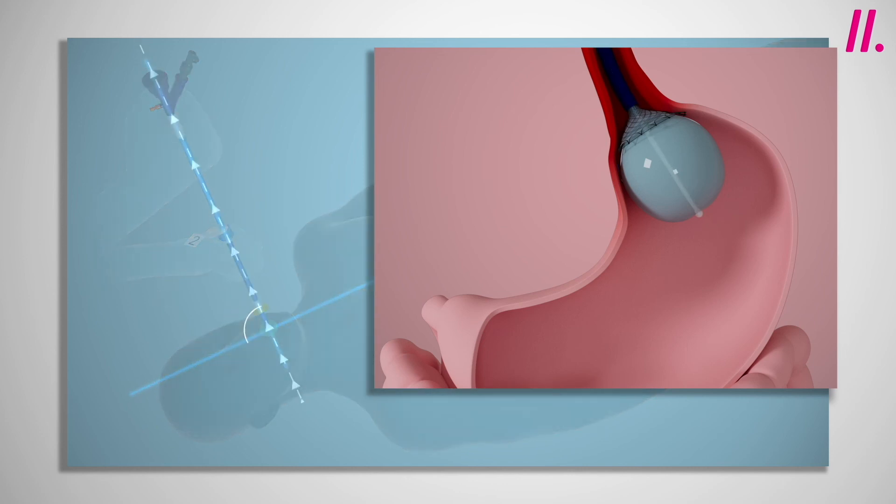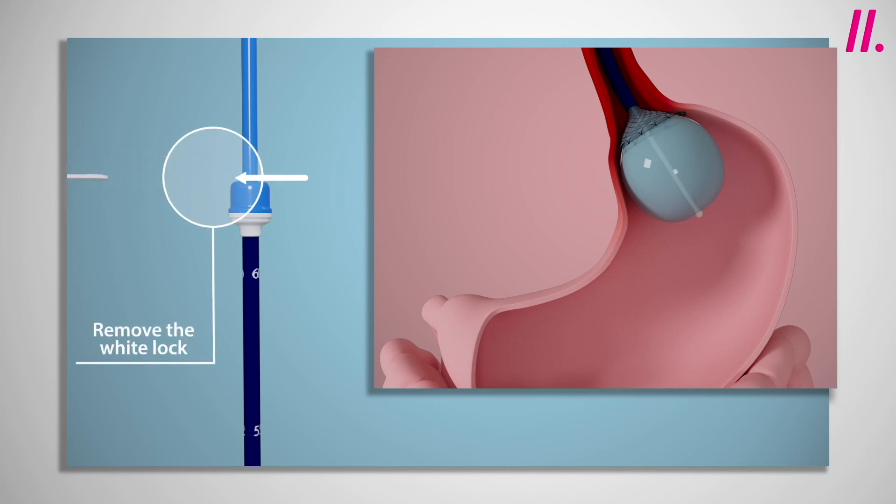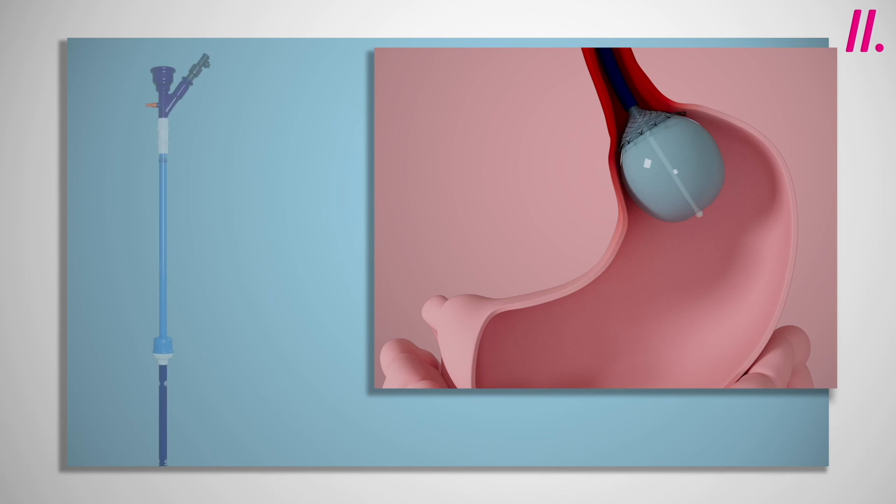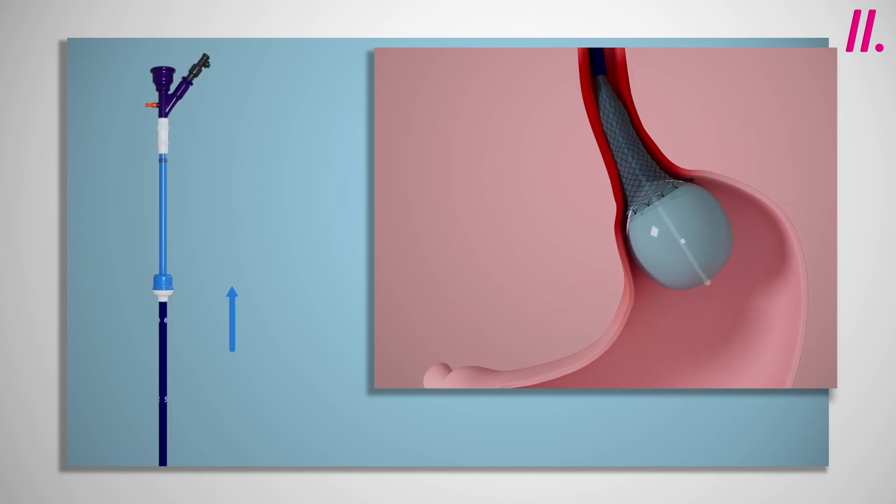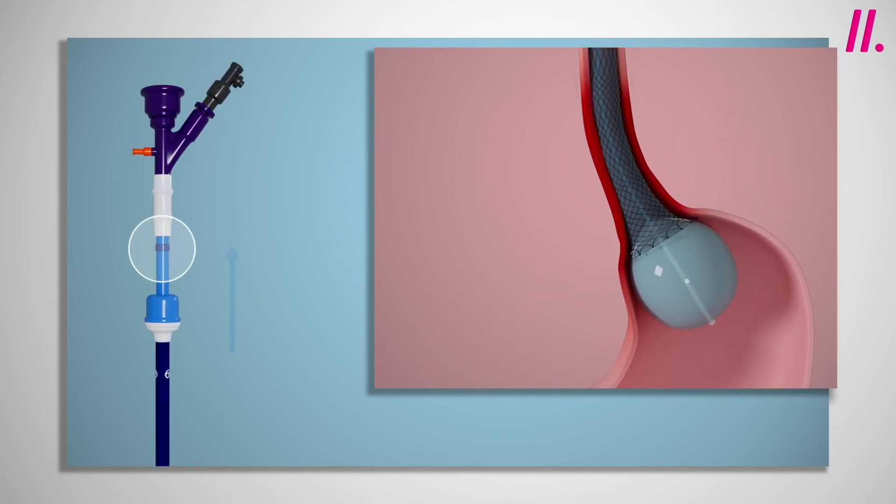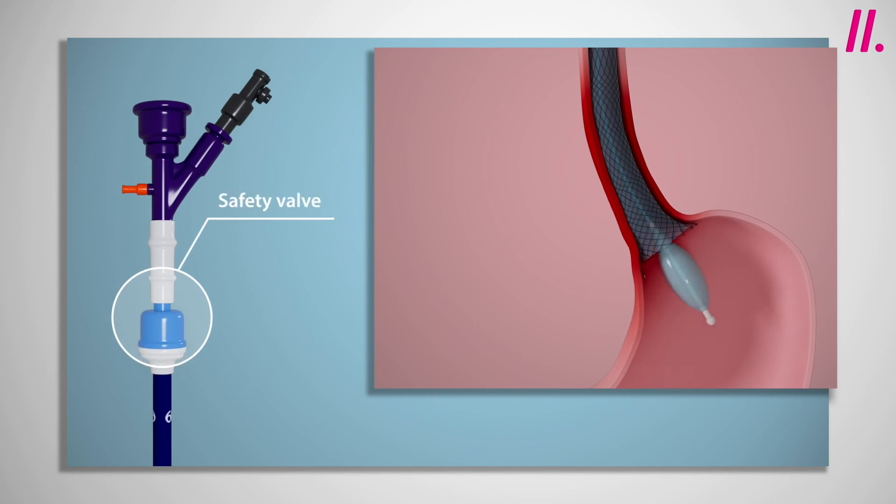The white lock, numbered 2, is then removed, and whilst maintaining modest traction on the entire system, the blue handle should then be pulled smoothly towards the end of the system, engaging over the safety valve. This deploys the stent and deflates the balloon.